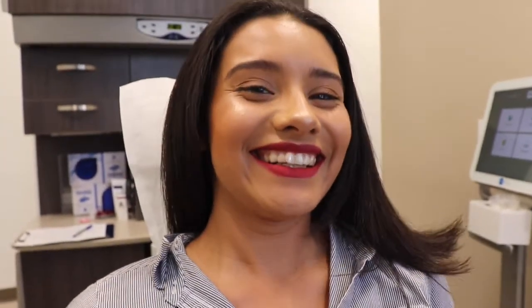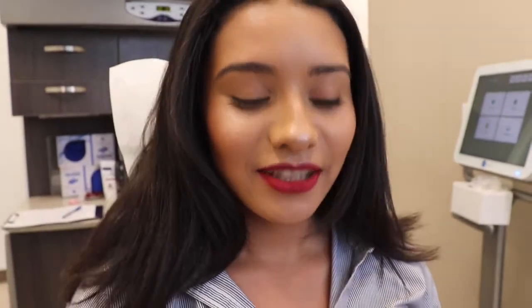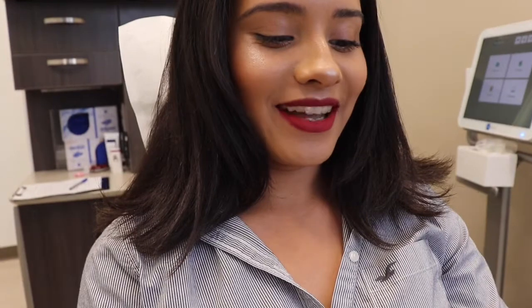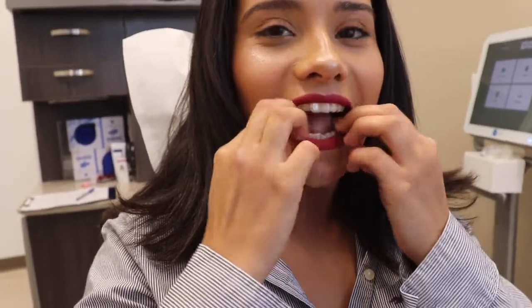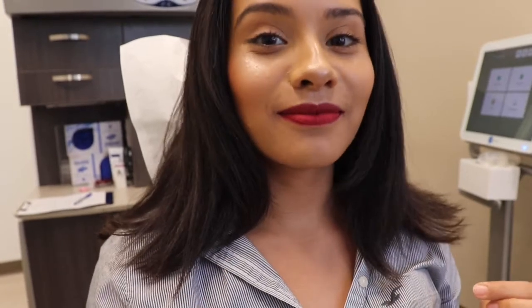I think I put it in. I'll double check it once you get them both in there. It feels so weird. Feel tight? Pressure? Go ahead and pop the bottom ones in. Sorry, I'm not a good cameraman. Oh my god. I like it. Good. So you're going to notice S's, TH's, things like that are going to feel weird. I feel like a vampire.